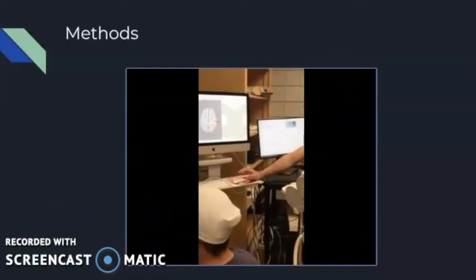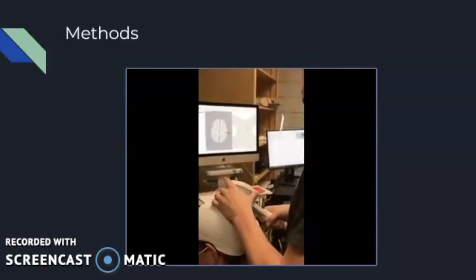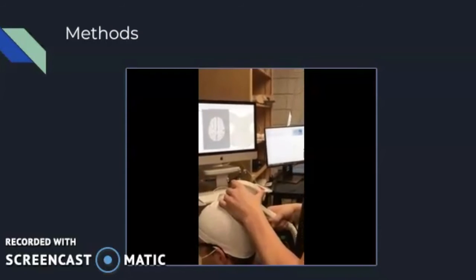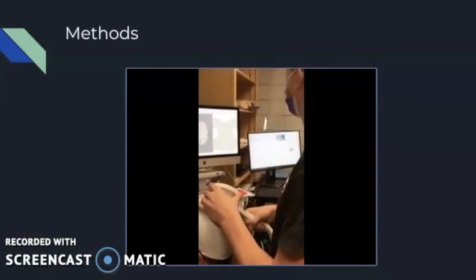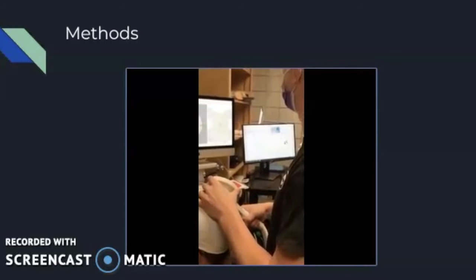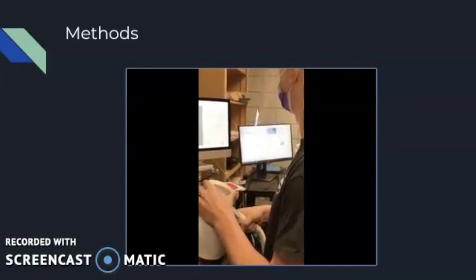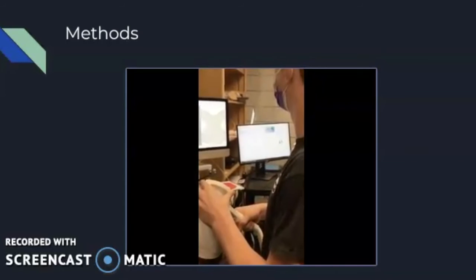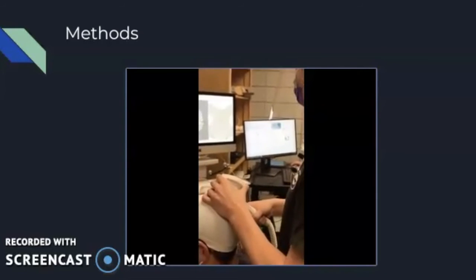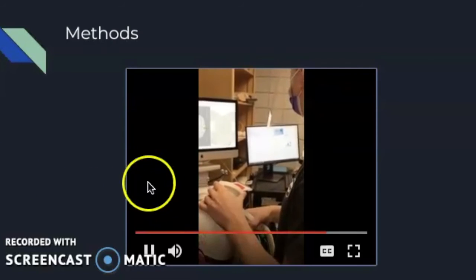In this video, I am shown on the right applying magnetic pulses of TMS to Sean's right motor cortex. I'm holding a TMS coil in my right hand and steadying it with my left. To the left of the camera, not pictured, Sean is wearing an EMG electrode on his left FDI muscle on his hand. To the right, the neuronavigation screen can be seen, which shows me where to apply the coil. To the far right is a screen that displays the motor evoked potentials that are read on the electrode located on Sean's right or left FDI muscle.